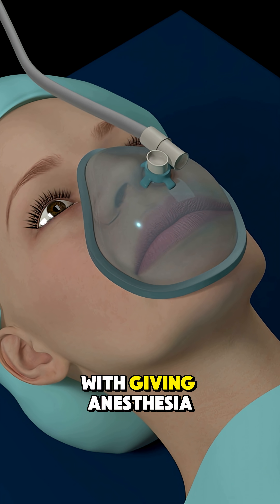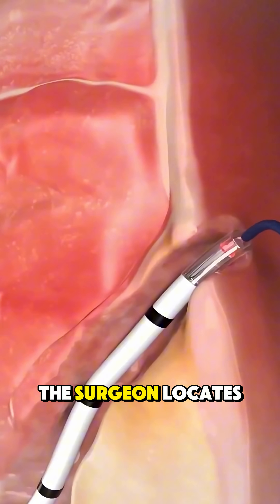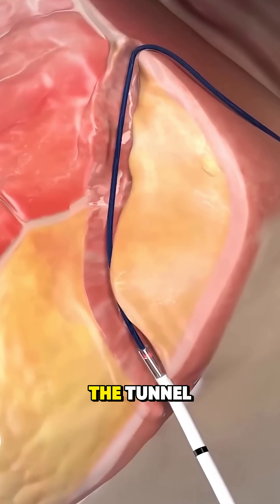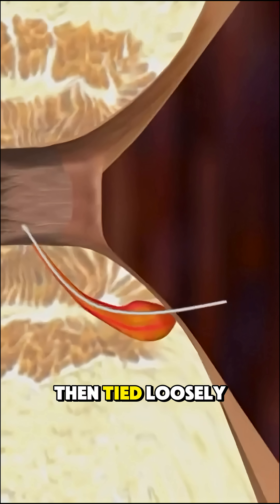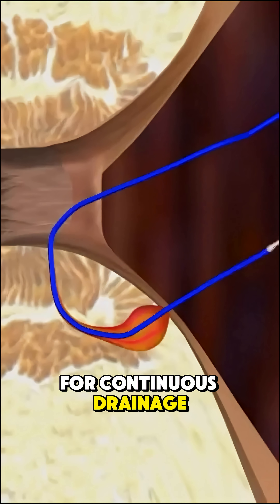The procedure starts with giving anesthesia so the patient feels no pain. The surgeon locates the fistula tract and carefully threads the seton through the tunnel so it loops in one opening and out the other. The seton is then tied loosely.